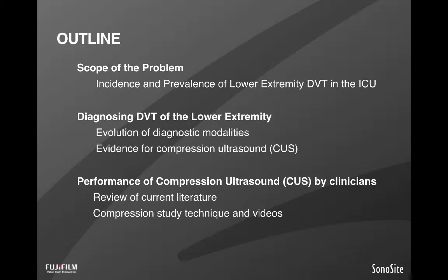There's a fair amount of literature showing that we can do it. In particular, we're going to end up discussing exactly how to do it and how to do it well. Obviously doing it well would require a lot of practice, but this would be at least a start, and hopefully a refinement of the technique for those who are already doing it. I will also include a number of examples.